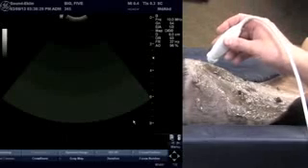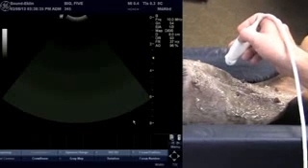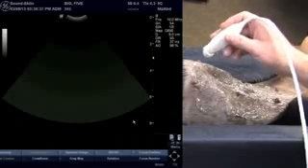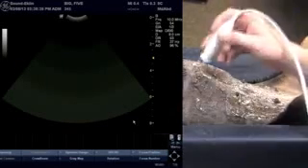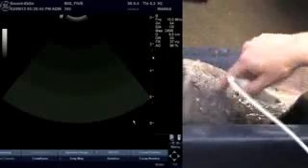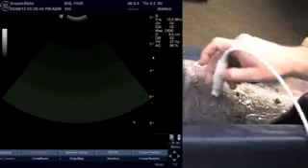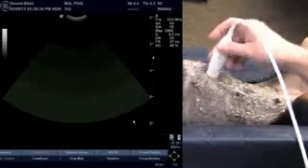We're going to begin our tour of the Big Five, starting with the liver, then moving on to the spleen, kidneys, and urinary bladder. We've got the patient positioned in dorsal recumbency. The abdomen's been shaved. You can see where we've shaved at least 3 intercostal spaces to give us access to the liver if we needed to from an intercostal approach.